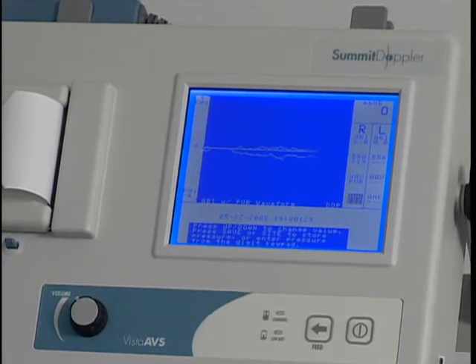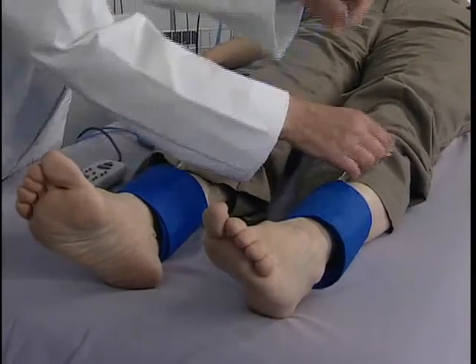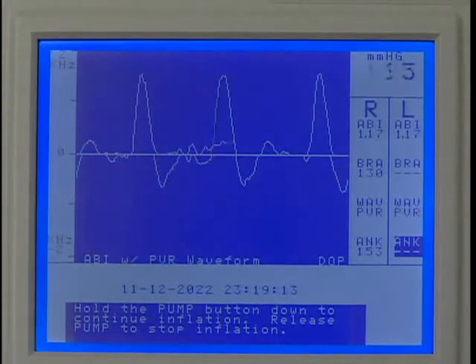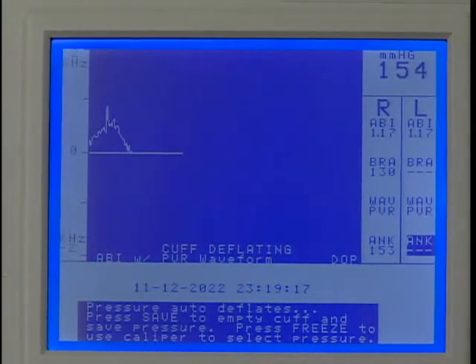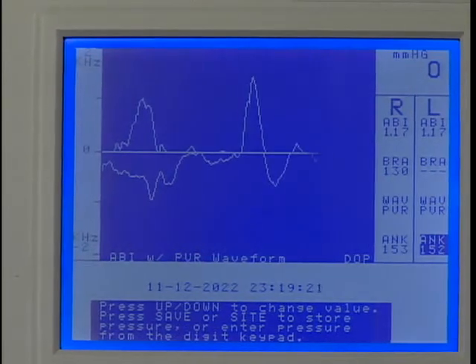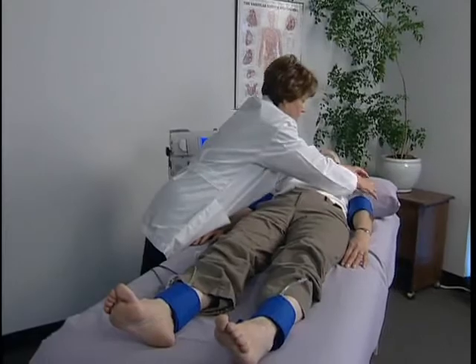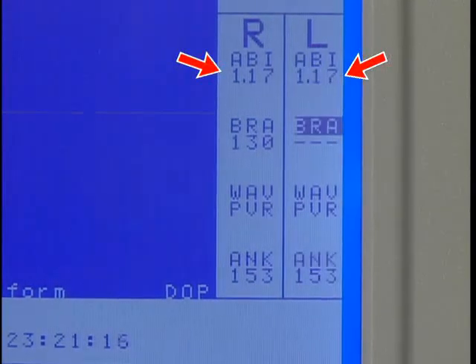Move the hose to the cuff at the left ankle and obtain the waveform as demonstrated on the right ankle. After saving, the marker will move to the left ankle pressure location. After obtaining and saving the left ankle pressure, the marker will move to the last location, the left brachial. Switch the hose to the cuff at the left brachial and obtain the pressure.